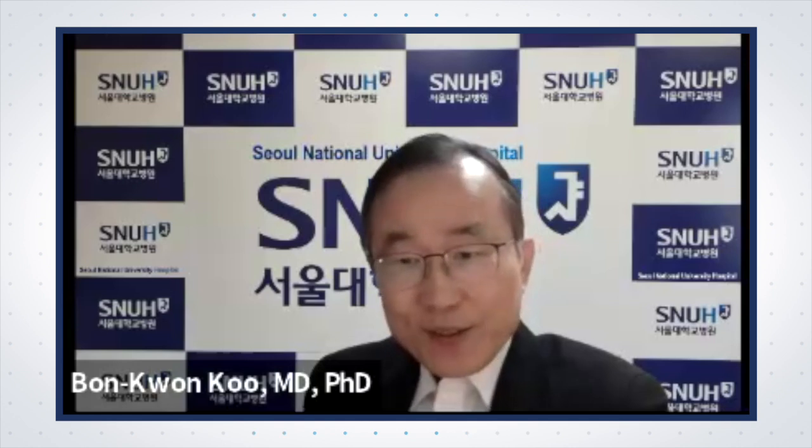First of all, thank you all for the excellent discussion. If I may add a minor comment, today we are talking a lot about CT-derived plaque quantity, quality, lumen, and hemodynamic assessment. Previously, it was simple because of the ischemia-guided approach: FFR-CT positive or FFR positive, revascularization. That's all. But now we are having far more information than that. So I think it's time for us to sit back and think about all the contributors.